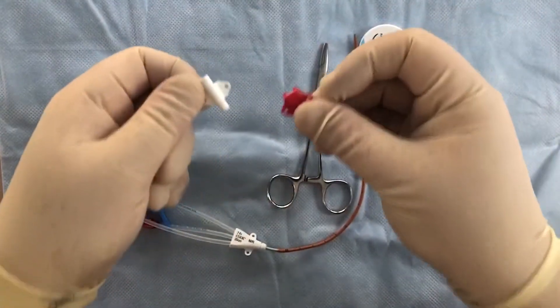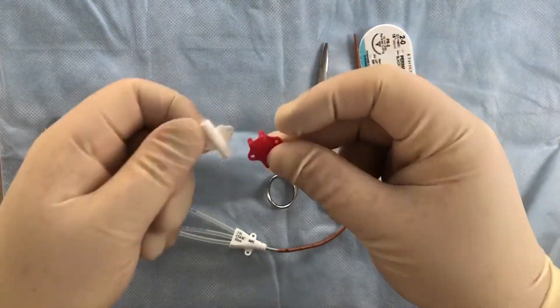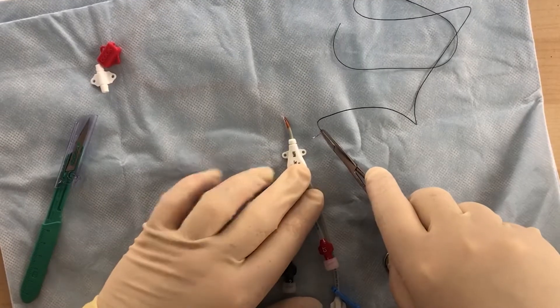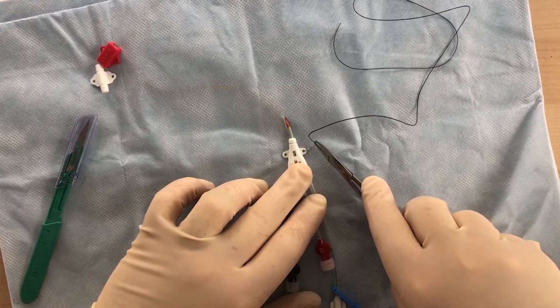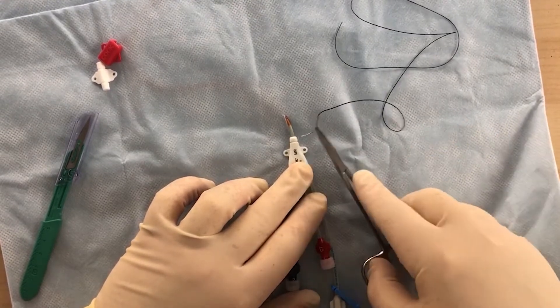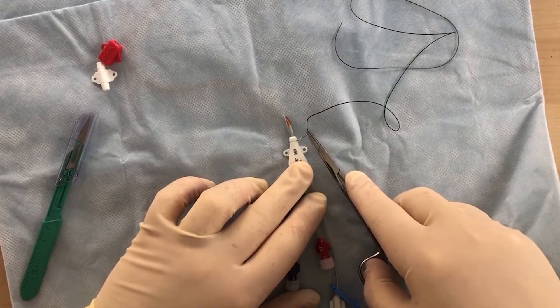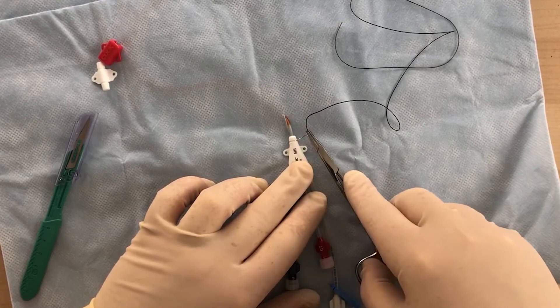We don't want to use this device — this is probably the source of the problems we've been having. I like to sew it in three places. You'll see these wings here and here — those holes are designed to secure it. And there's a little indentation on the hub here, which is a third position to secure it. It's best if you secure it in all three positions.